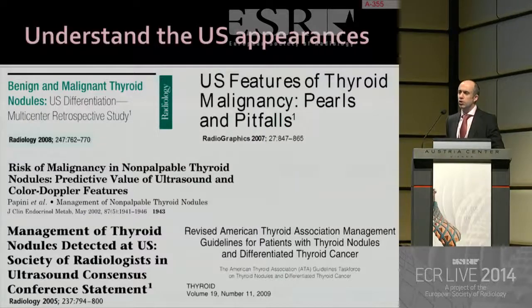So having understood a bit about the incidence and mortality of thyroid cancer, our next duty as radiologists is obviously to understand the ultrasound appearances. There are legions of very good articles on the internet regarding ultrasound features of benign and malignant nodules with their sensitivity, specificity, positive and negative predictive values. Now, we go away, we read all of these, and we understand it.